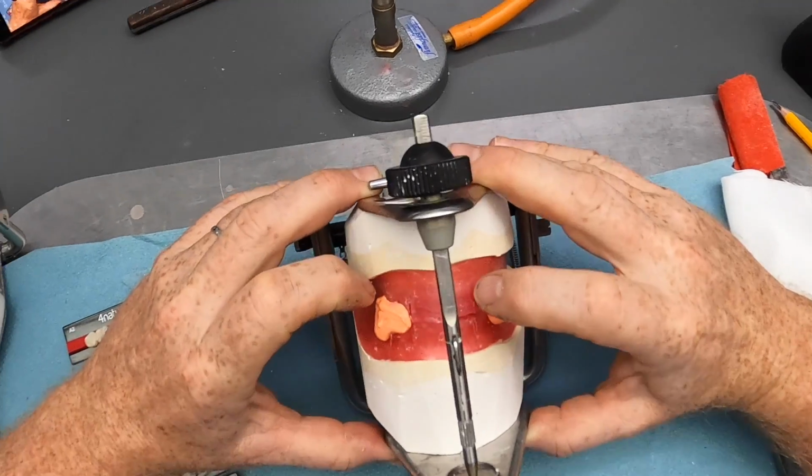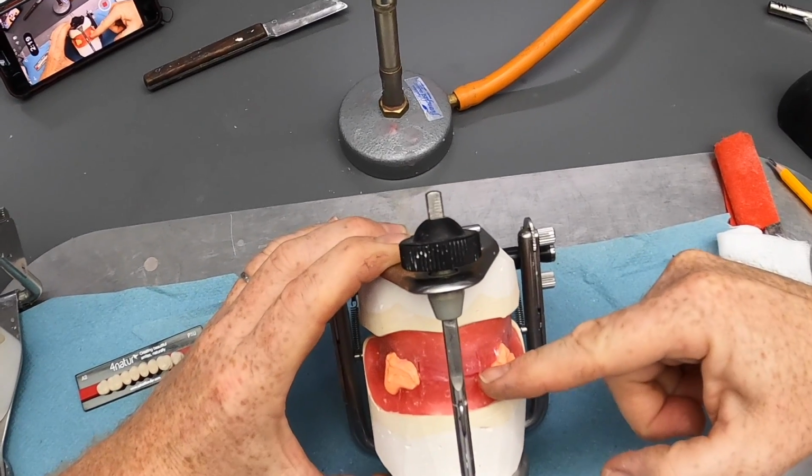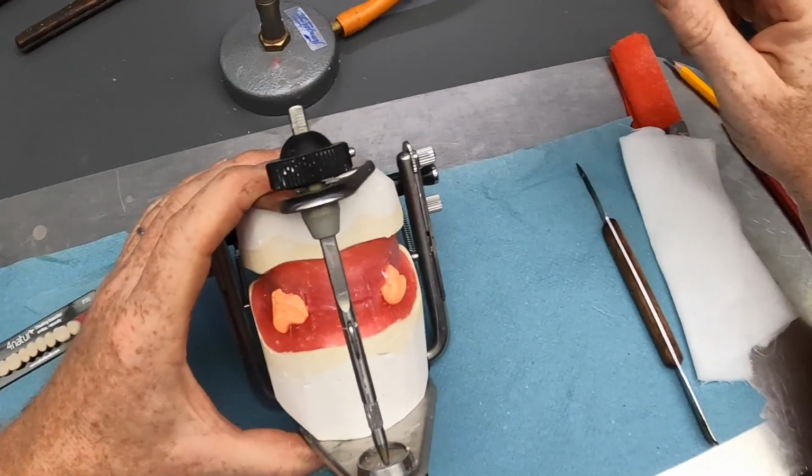really we're working to aesthetics and of course supporting the lip with the teeth. They provide the most of the support for the upper lip, and of course we want to keep on the occlusal plane. Now people do a few variants at this stage that people do.